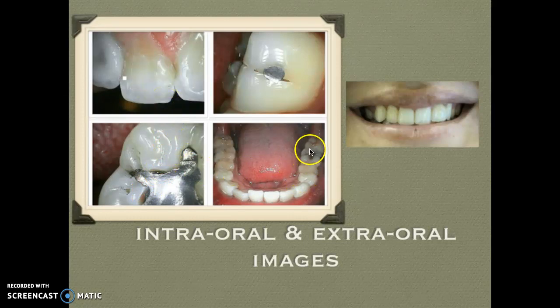So you can also see that we can get an occlusal image, but not quite as good as with the camera in dental photography. An intraoral camera can, however, in some instances take extraoral images by holding the camera just outside of the mouth so we can get a smile image there. Again, these intraoral cameras are very helpful for patient education and patient approval of treatment.